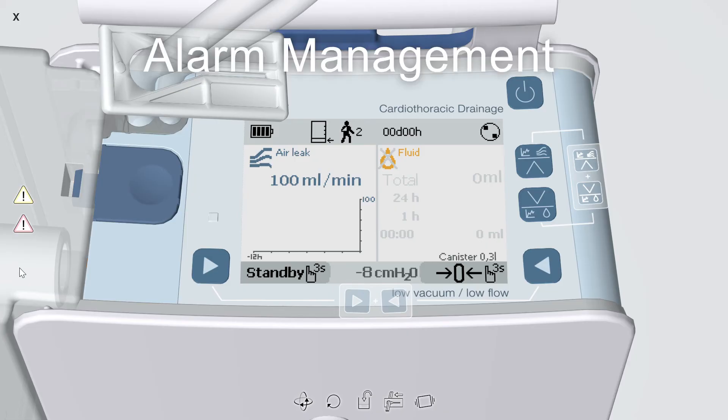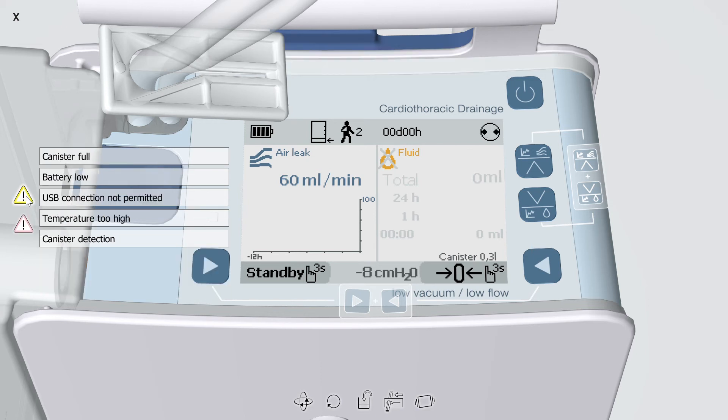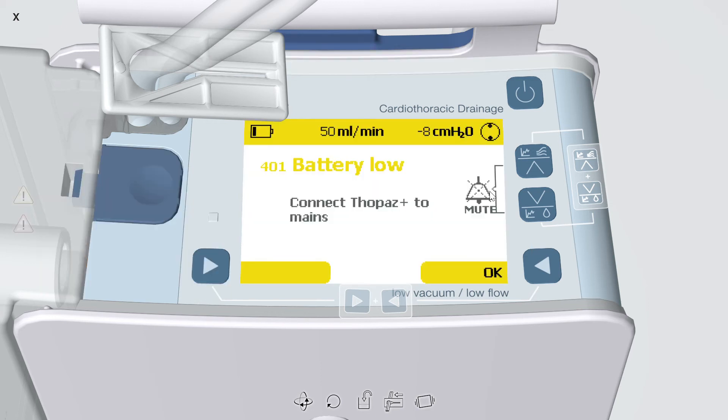The acoustic signal for a warning or an alarm can be temporarily silenced for 60 seconds by pressing the up and down arrows simultaneously. To troubleshoot, simply follow the instructions on the display. For a battery low alarm, all you need to do is plug the device in and press OK.